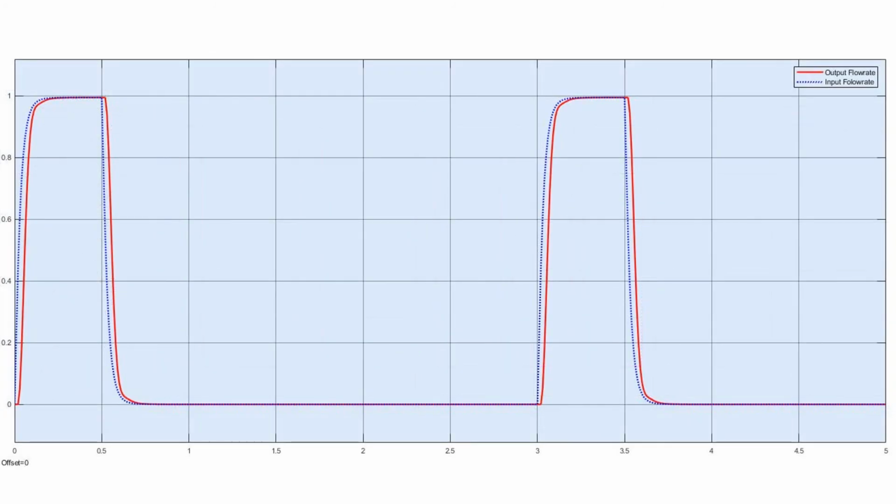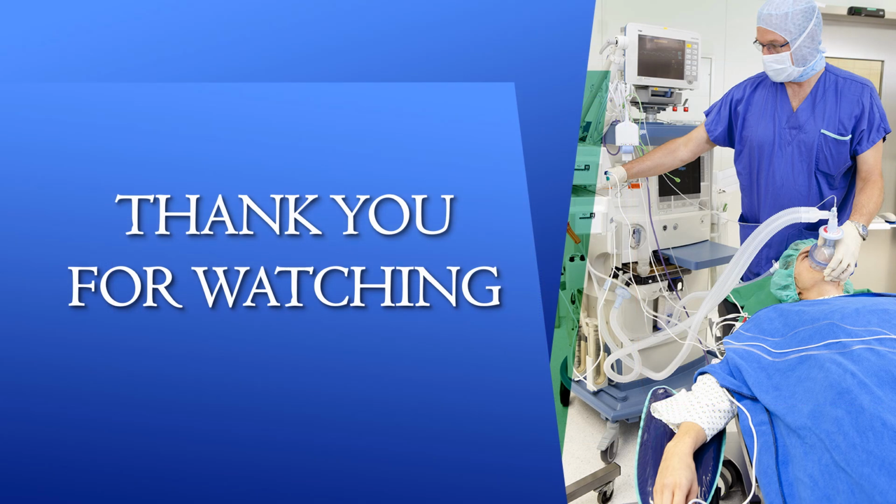We can conclude that the outcome, after adding a closed loop with a PID controller, is an output signal which almost perfectly follows the input flow rate pattern. Therefore, the objective of the project has been reached with the expected performance.